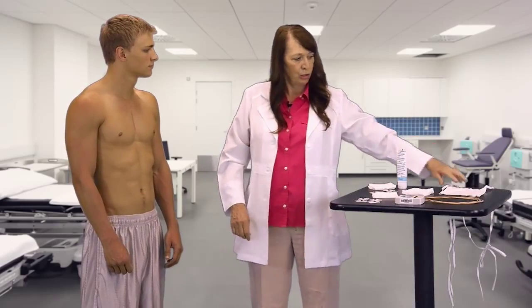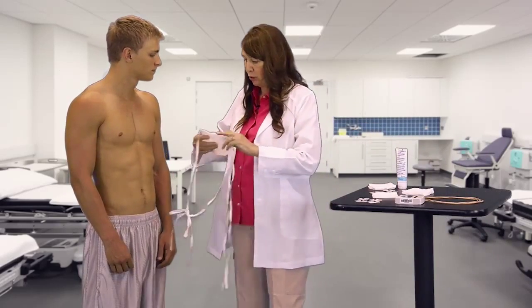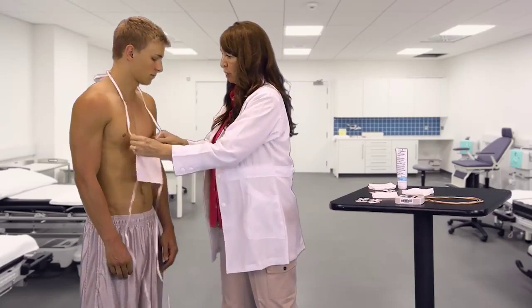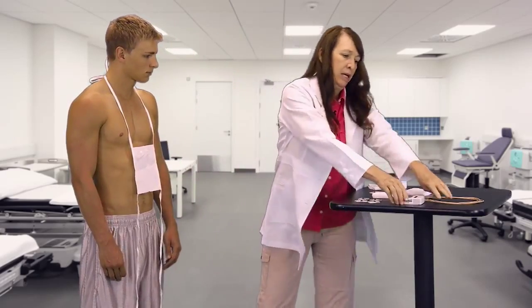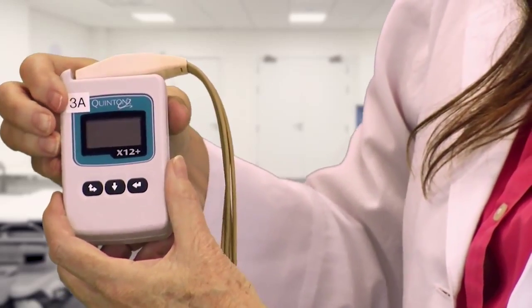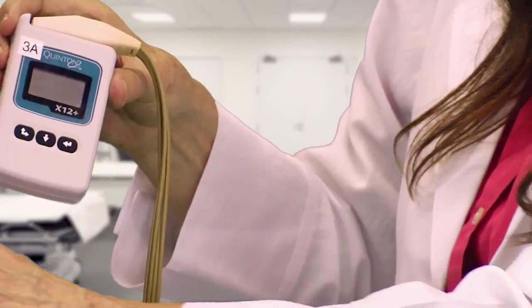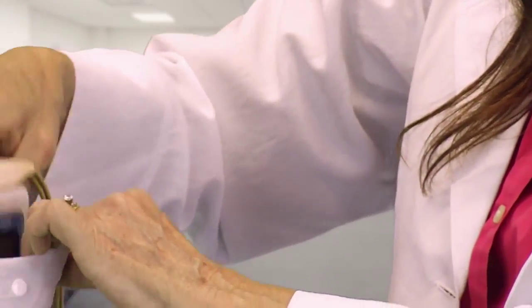We're going to start with the pouch because you're going to learn how to put this on yourself before you come into the gym to do your exercise session. This is the monitor. On the right hand side there is a transmitter number — you'll want to remember to tell whoever is behind the computer. Put it in your pouch.